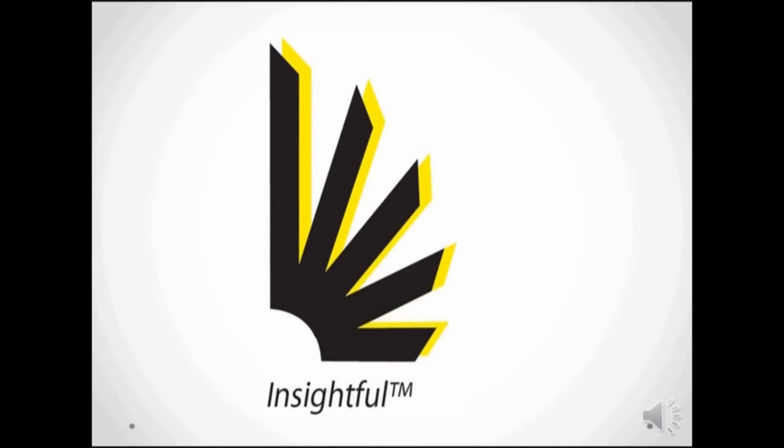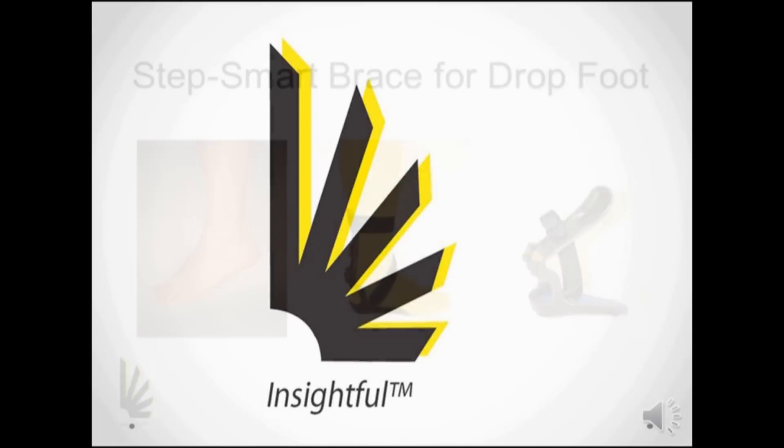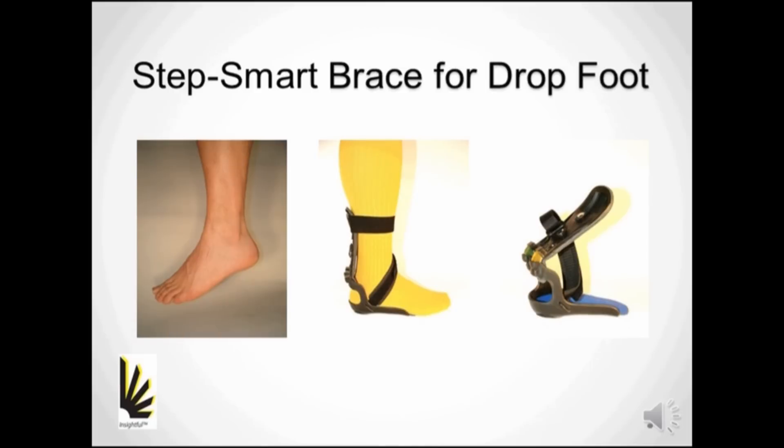Inciple Products is an R&D company specializing in human ambulation. Our StepSmart Brace is the first drop foot brace that manages both swing and stance phase.